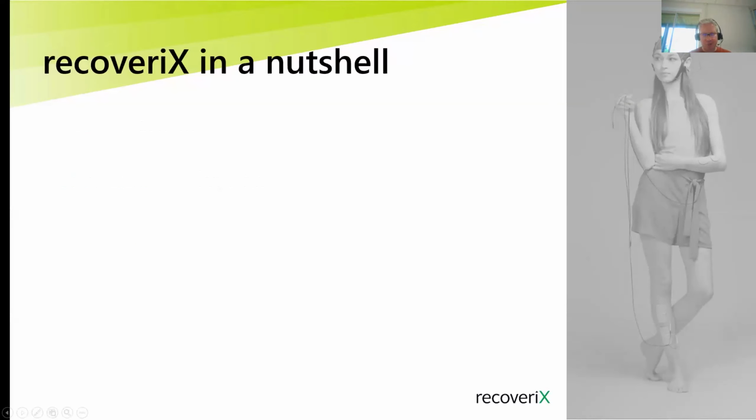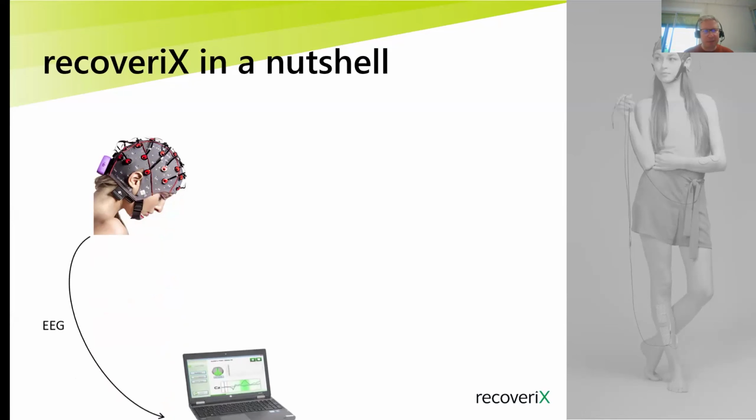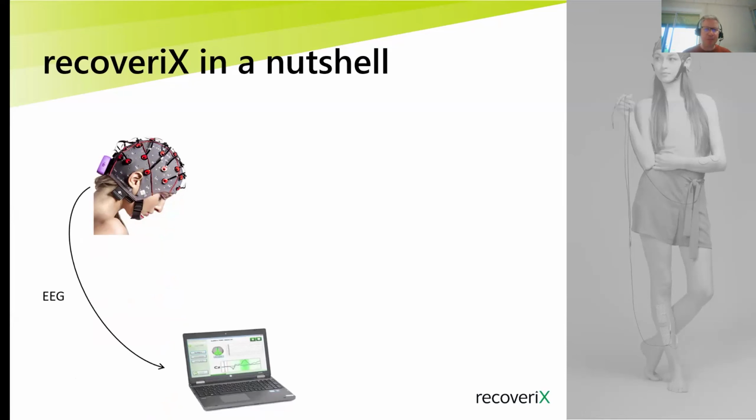So just very briefly, in case you missed the introduction by Christoph in the morning, then of course I highly recommend you watch it again. But to give you an idea what recoveriX is, very briefly in a nutshell. So recoveriX, our tool for neurologic rehabilitation for stroke and other diseases, measures the brain signals via the EEG.